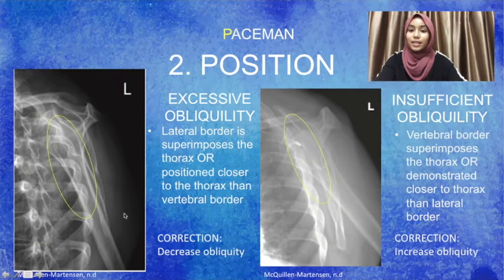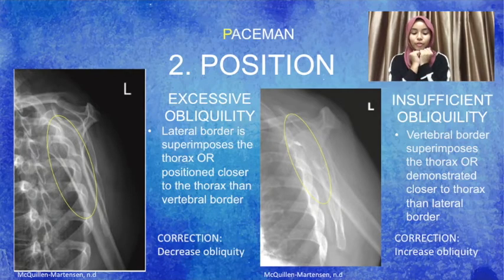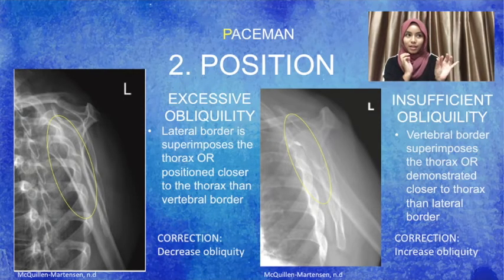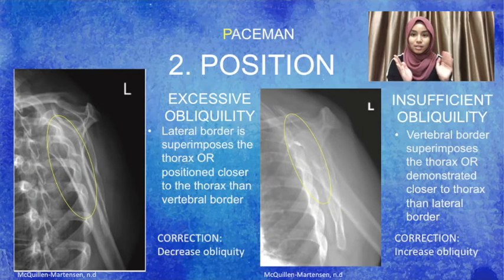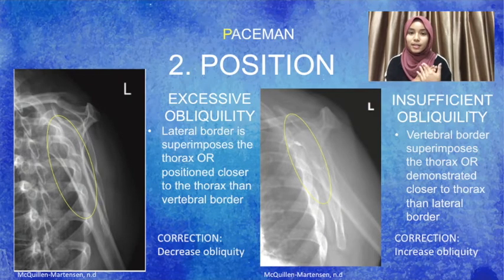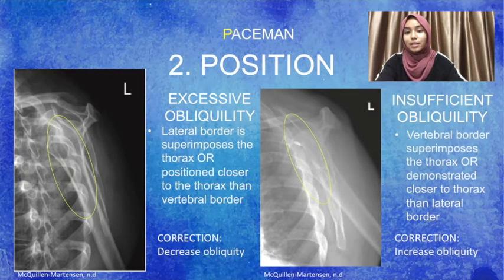For the next position, how to differentiate between the vertebral border and the lateral border: the lateral border is quite thick and demonstrates a true cortical line of approximately 0.6 cm or 0.25 inch. The vertebral border, however, only appears as a thin line. There is also a possibility for a patient's position to be excessively oblique or insufficiently oblique.